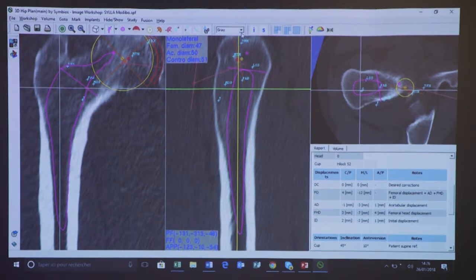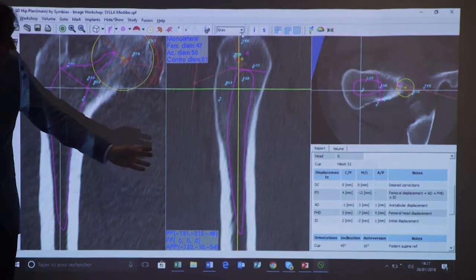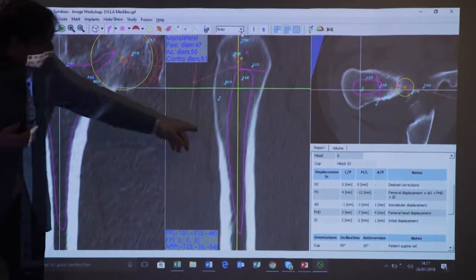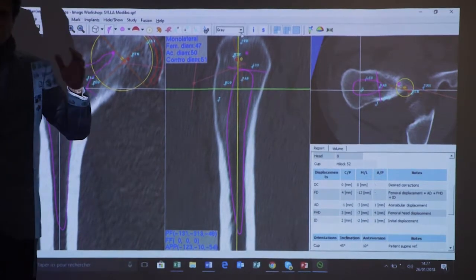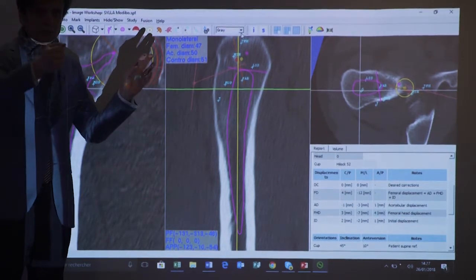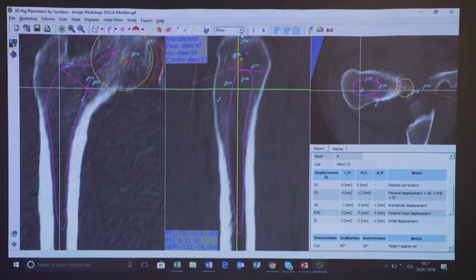So in my experience, when we have these Dorr A femurs, not the Dorr classification analyzed on X-rays, we can have the same thinking in the coronal plane, but also in the sagittal plane. So it's a high flare, including in the sagittal view, and this is much more difficult to deal with. For example, when someone is sitting and stands up, this is where we'll start to have maximal constraints, and this sagittal stability is very important.